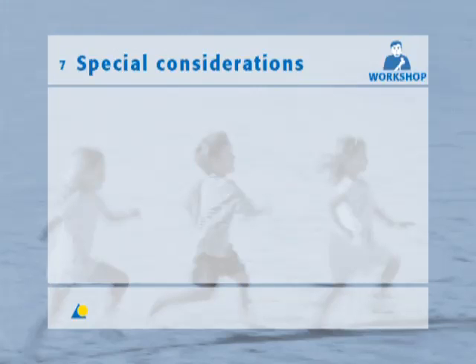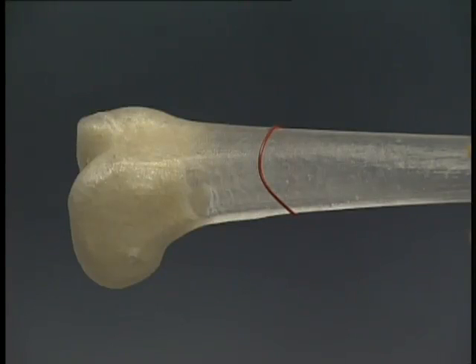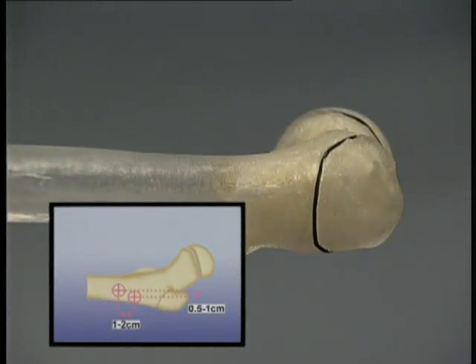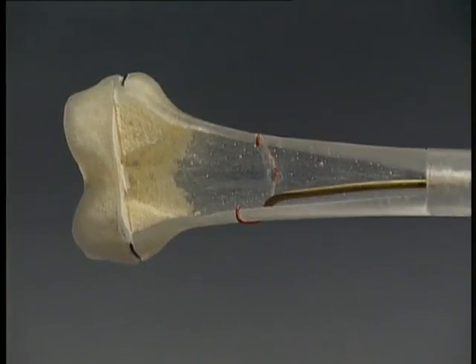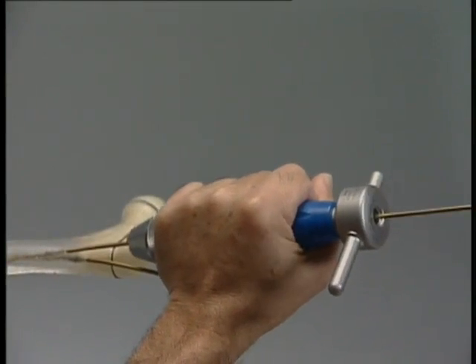For fractures of the distal third of the femur or the distal metaphysis, it is preferable to use the descending monolateral technique. From here on, only the variations from the standard technique are shown. The insertion points for the nails are located anterolaterally below the trochanter, about one to two centimeters from each other lengthways and 0.5 to one centimeter transversely. If the insertion points are too close together, the bone could split. The nail, pre-bent especially at the tip, is inserted, and the fracture may be reduced and primarily stabilized with the nail.